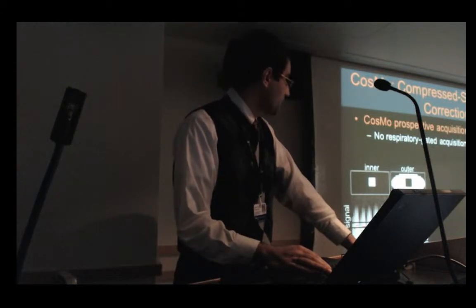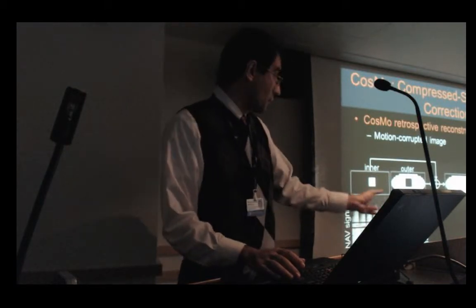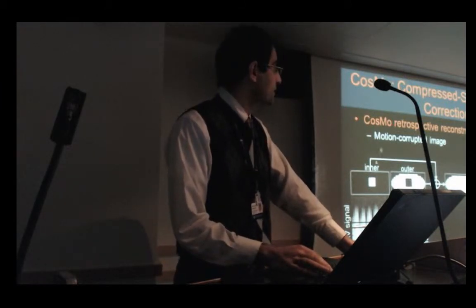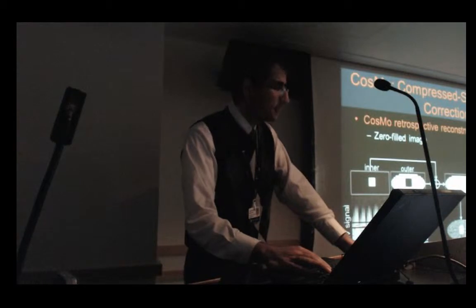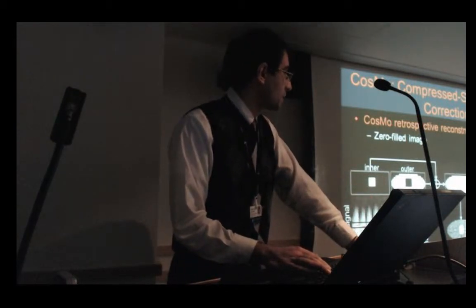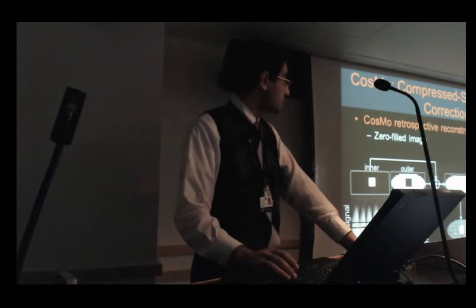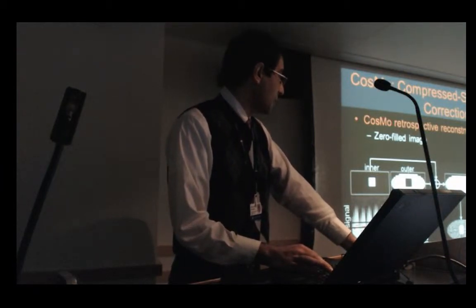So for prospective implementation of the algorithm, we went to the scanner and we changed the K-space profile ordering to acquire the center within the 5-millimeter gating window. Again, within the 10 to 20 heartbeats, we suppress the respiratory motion using the narrow gating window of 5 millimeters, and then we open up the gating window to accept the rest of K-space lines and to acquire the outer K-space region, which has a much smaller amount of energy. And then we add these two acquired K-space together to generate the semi-corrupted image. I call this semi-corrupted image because the center of K-space is acquired without respiratory motion, and the rest of K-space lines are acquired with the respiratory motion of the heart.